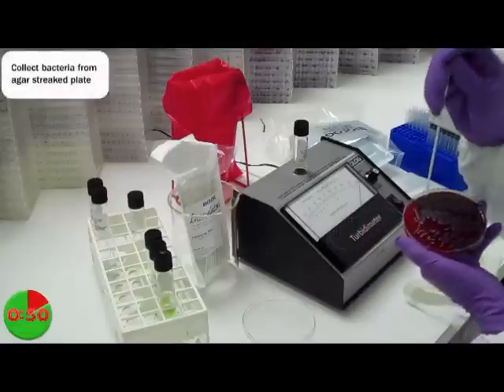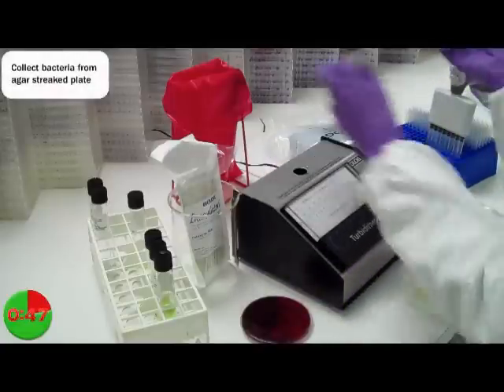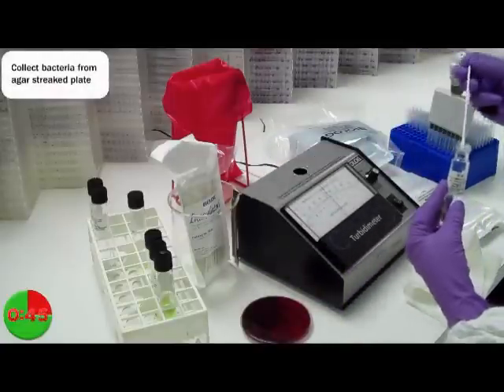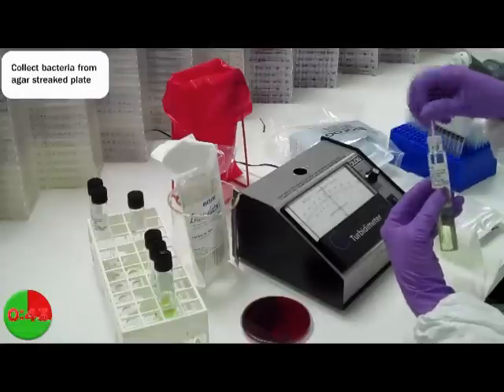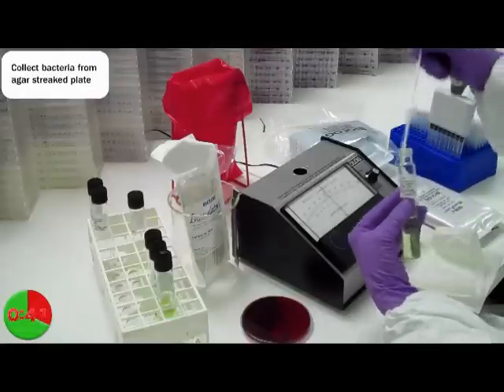Collect your sample by holding the inoculator swab vertically and touch the end to pick up bacteria from the auger streaked plate. The swab will automatically collect the amount of cells needed for the test.